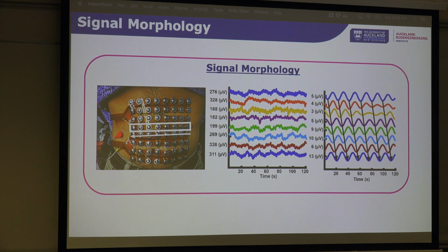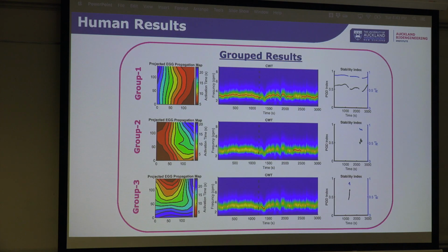And so this match, just a similar plot to what we showed in pig. Once again, we can see those waveforms moving across the body surface in the correct direction. And then we can move on to the results, similar to what we just showed for the pig studies.